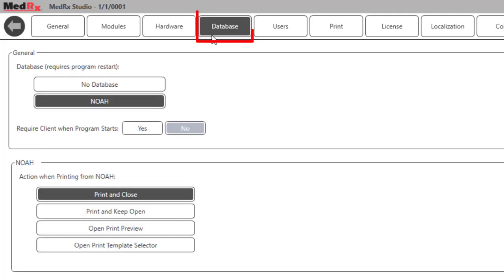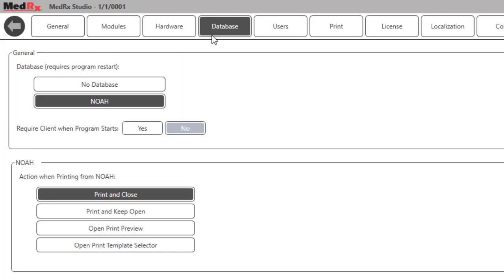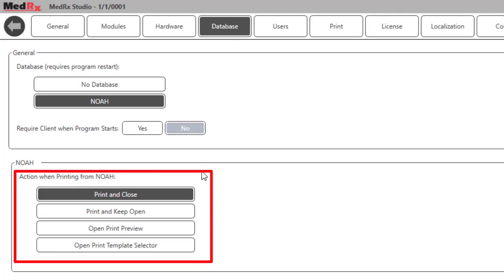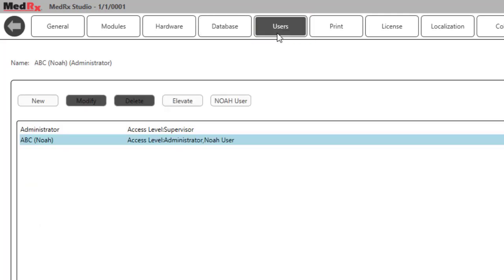The Database tab is used to select to use the NOAH database or not at all. The NOAH option determines what will occur when printing a report. The Users tab will allow you to set user preferences and options for testing, and testing may be set up and saved per user when default settings and test preferences differ.